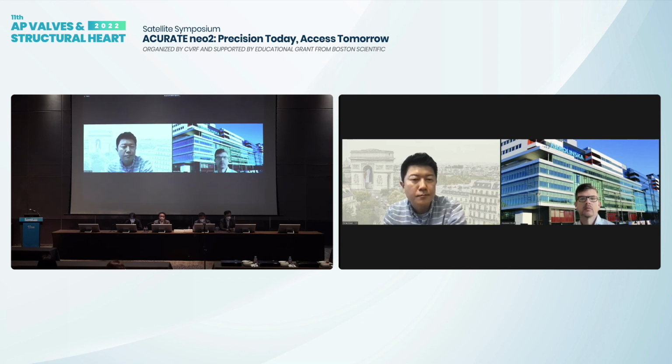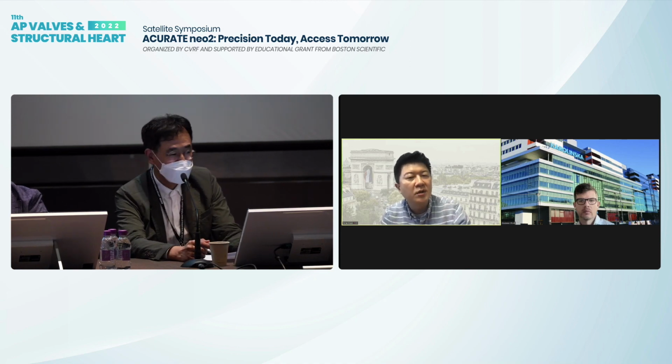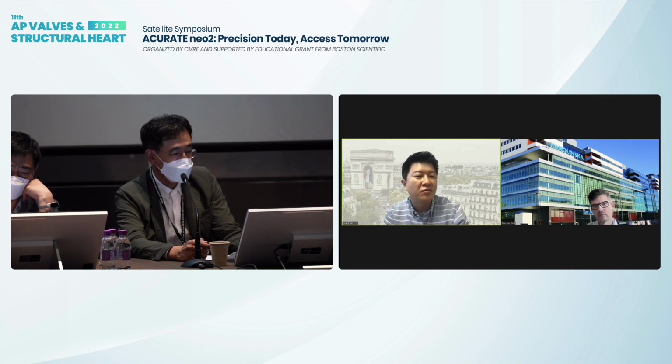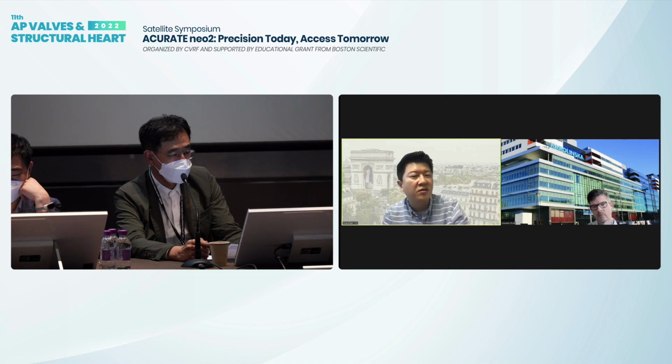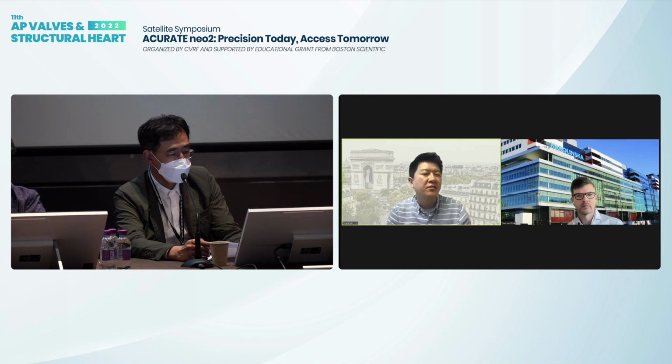I have a simple question to Dr. Kim. In your valve embolization case, you put another type of valve. So in this situation, we have to prepare another type of valve? Exactly, yeah. We have the most experience with Sapien. In 90% we use Sapien, but you can also use Medtronic, Evolut. We have also experience with a second ACURATE. So actually we have experience with all combinations, but it depends on the mechanism, whether it's pop out or whether there's still some contact with the annulus, or whether it embolizes into the left ventricle. But usually with any one of the commercially available valves, you can address this complication.